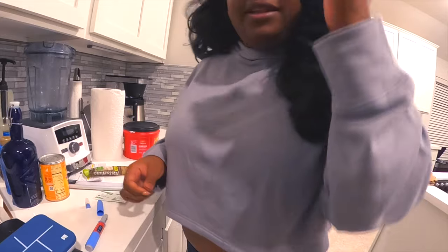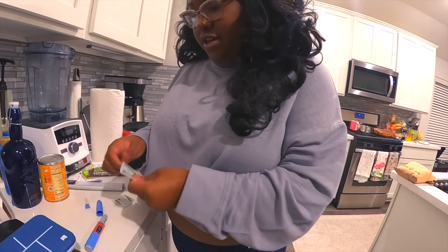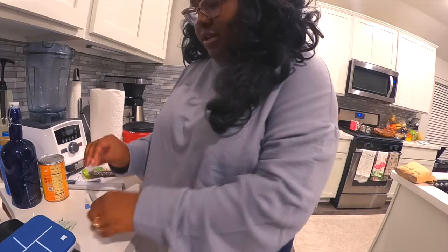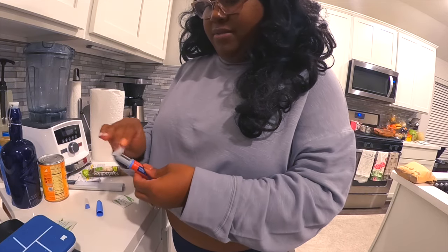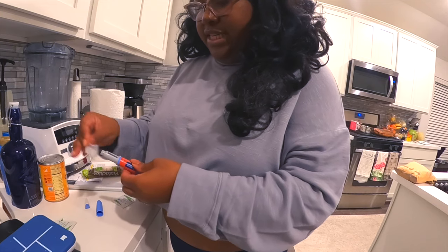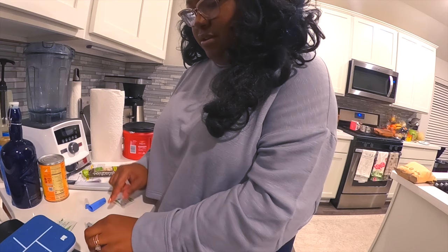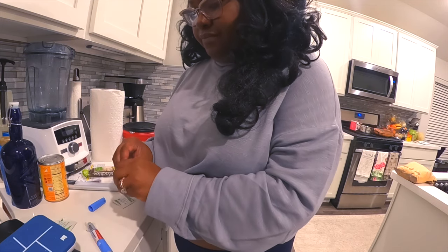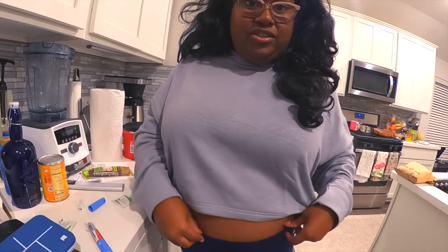You're going to be able to hear me but not see me, and that's okay — you don't need to see my face for this. Taking my first alcohol swab and just swabbing the outside of the pen, making sure it's clean.